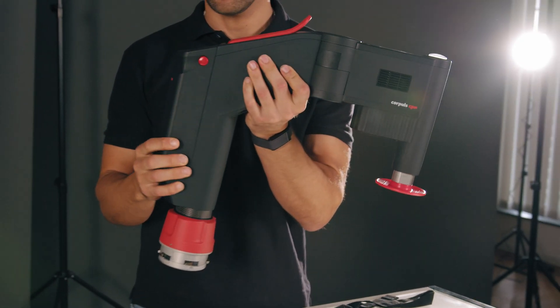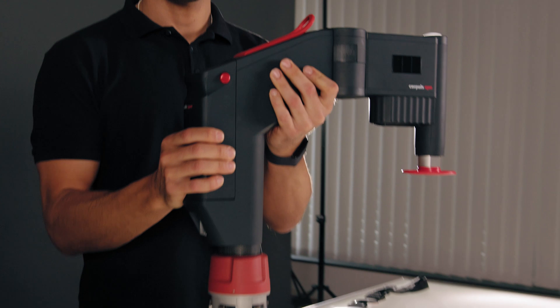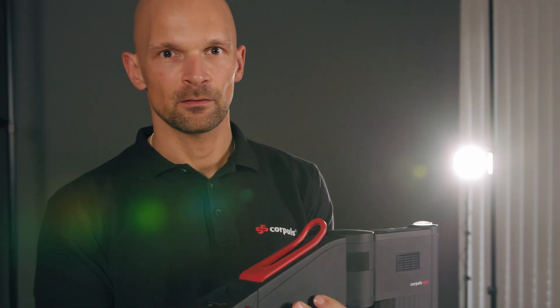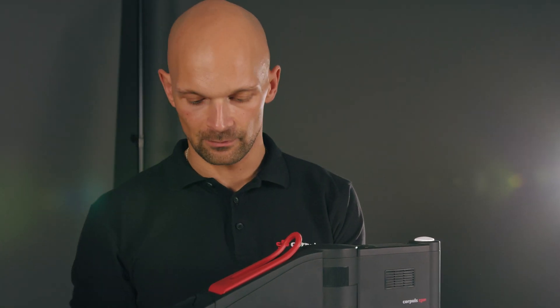In contrast to the contents of the bag, which is variable, the Corporal CPR operating controls are always the same. First of all, the bayonet lock to connect the arm to the board. It clicks into place when I place it directly on the board.